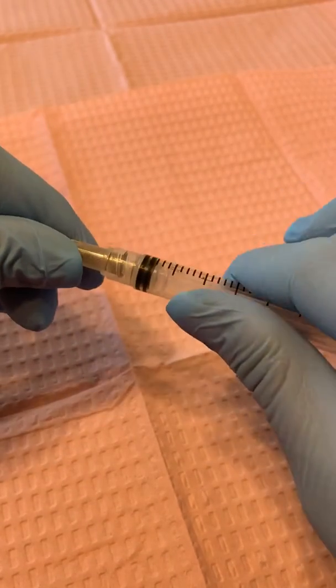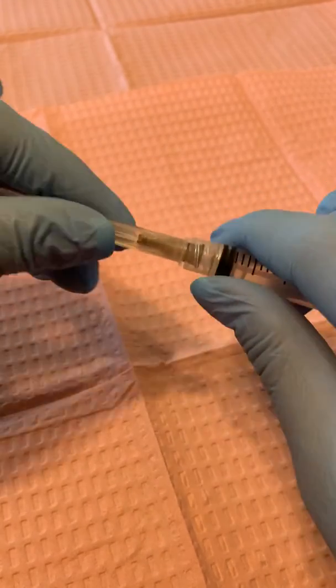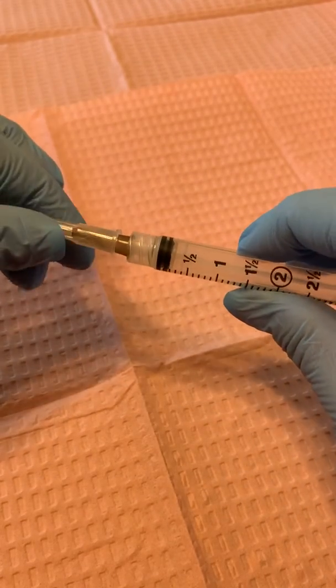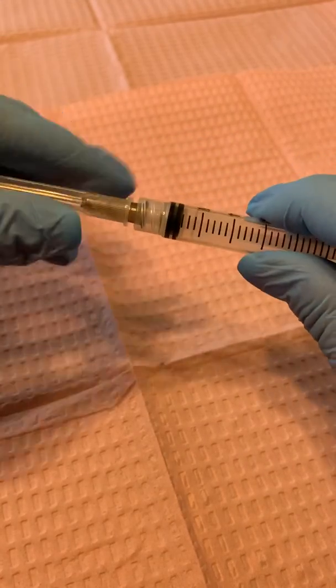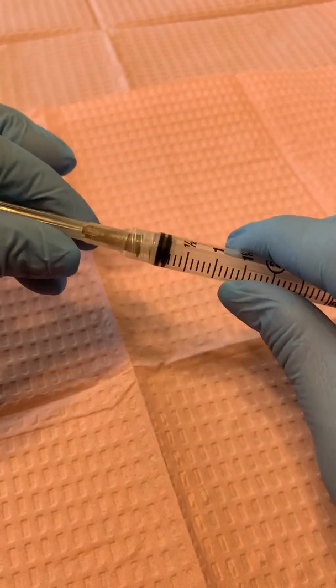I'm going to tighten that — not too tight because I am going to switch out the needles — just enough that the liquid isn't going to come through when I am drawing up the medication. If you don't tighten it just a little bit, the needle can come off while you're drawing medication or the medication can leak through. I just like to tighten it up until where it stops.